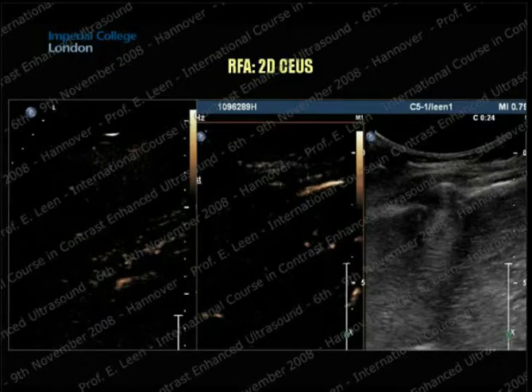And what you want to see is whether you achieve complete ablation, and you want to make sure that that area is completely devascularized. Okay. Now it depends on the time you do it. You may find peripheral rim enhancement. This is the benign enhancement that you see from hyperemia.